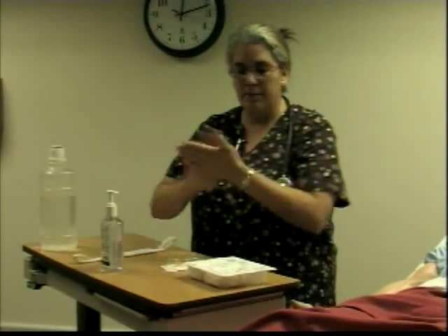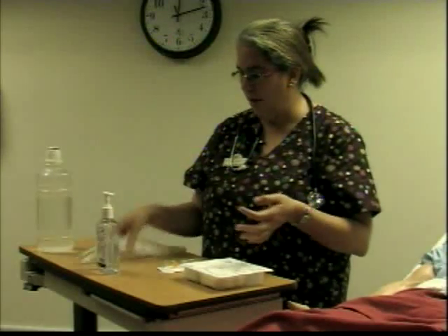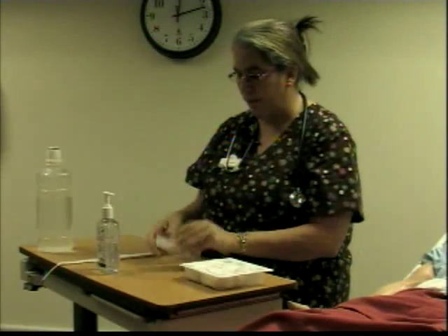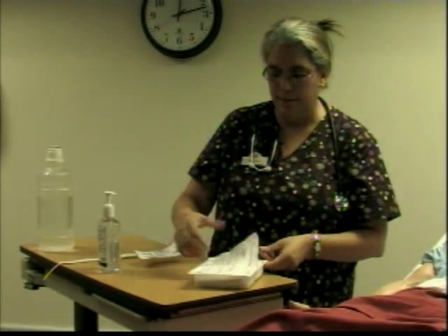Okay, so you already did all your assessment on your client, and you will wash your hands and get ready to go. You have the red bag and you have everything that you need in there. You already opened your packet to have your tube holder. You want to make sure that you open your packet and have it ready to go for your inner cannula, and you have it right there. And then you're going to open your packet for your cleaning.